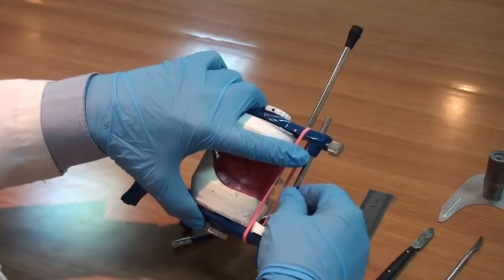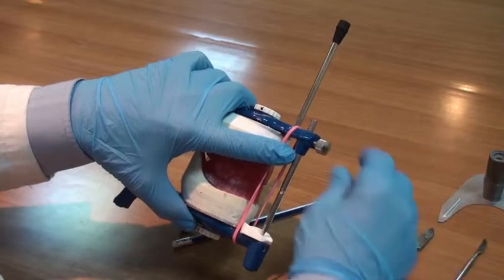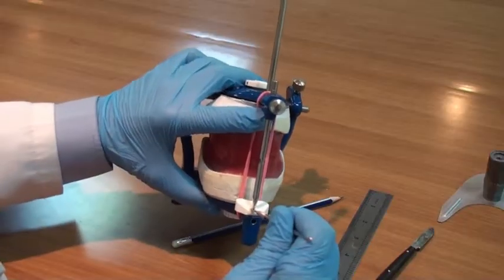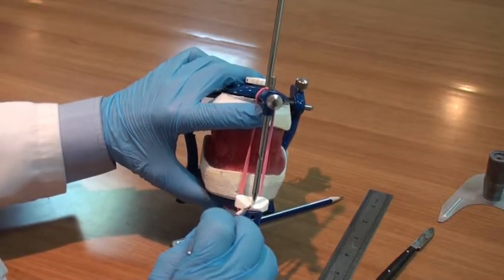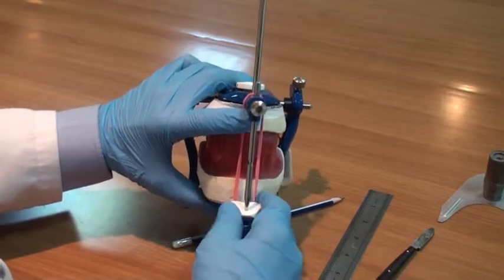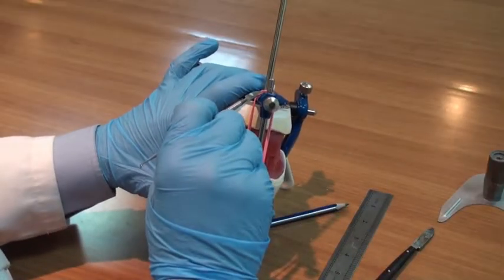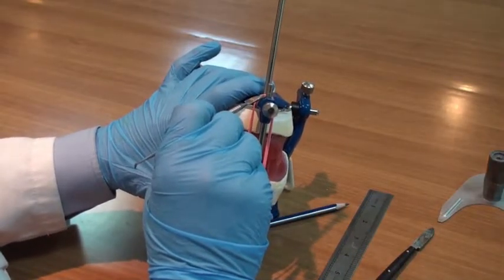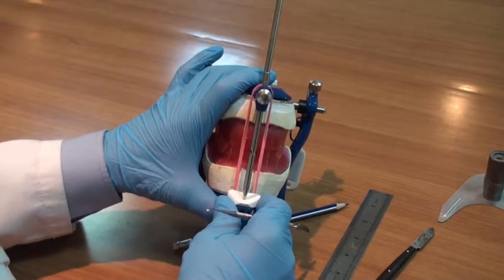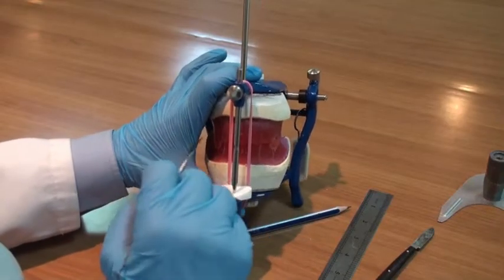This zero line must be flush with the upper member of the articulator and must close tightly to the incisal guidance table. Now, the arrangement of artificial teeth must not increase or decrease this vertical dimension of occlusion. Otherwise, this will affect the freeway space inside the patient's mouth.